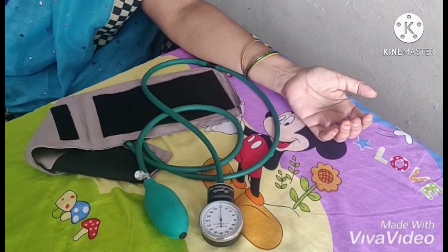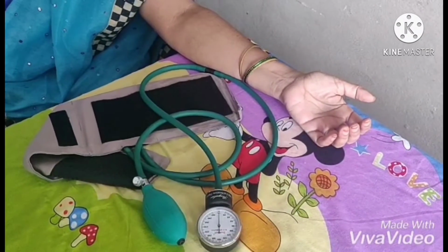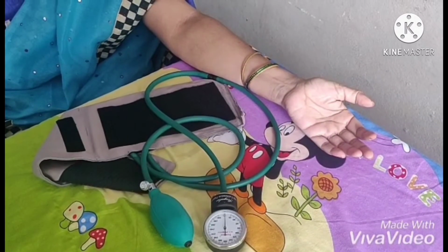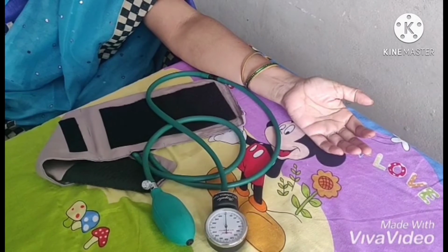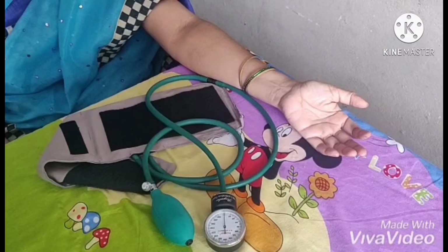During blood pressure measurement, the following precautions are required. The subject should be given at least a few minutes of rest. No tight clothing is advisable. The arm of the subject should be completely exposed and kept at heart level. Keep the cuff at the heart level of the subject.